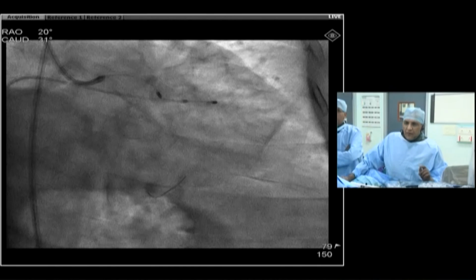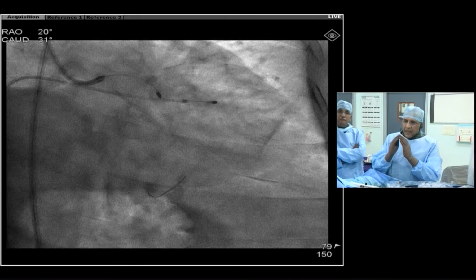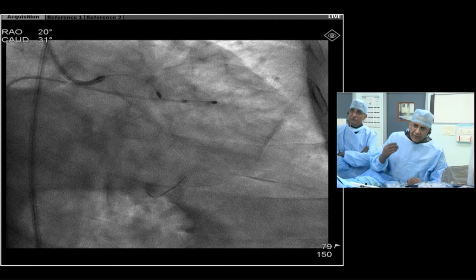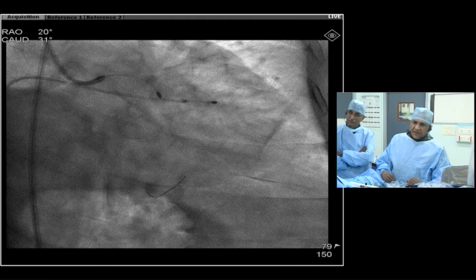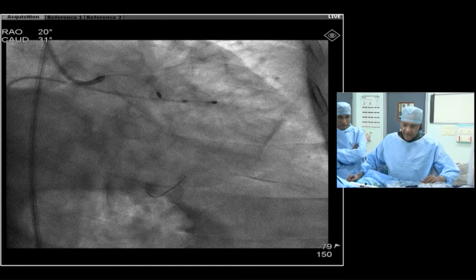Nothing happens to the diamond. But tomorrow I'm going to give a talk, and I'm going to show you that the tip is nickel, and because of the heat, the tip gets roughed up. Over a period of time, it kind of opens up like a flower, completely conical, and then the ablative surface does not touch. That's how the burr fails. But you need a soft metal because otherwise it'll burn the wire.